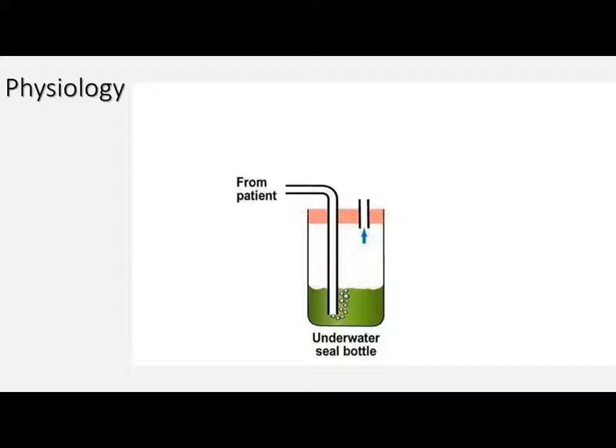Now this works fine in the setting of a pneumothorax, where all that's coming out of the patient's pleural cavity is air. In the setting of a hemothorax, as the blood tends to collect in the underwater seal vessel and it fills, there's going to be an increasing positive pressure generated back up through the chest tube into the patient, and eventually as that fills up, it'll either overflow, or it'll cause an occlusion of the chest drain, and essentially we'll have a closed pneumo or hemothorax once again.